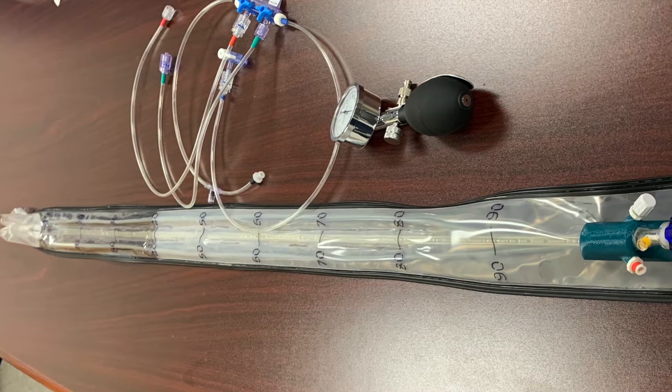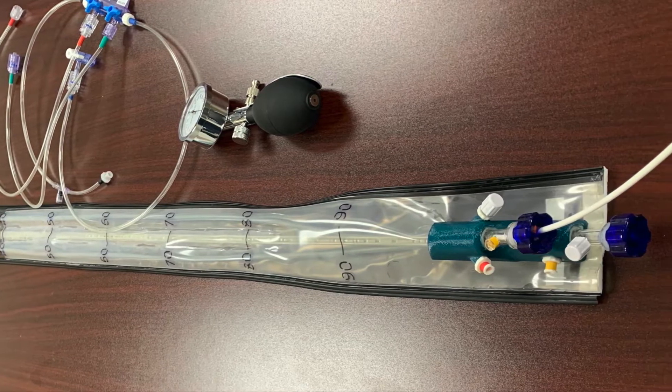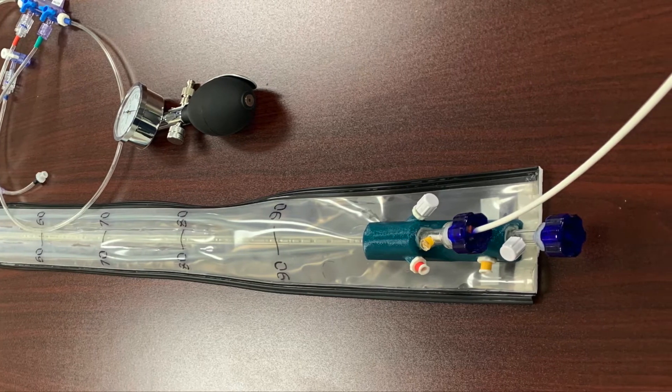Years later, and several iterations, we have Isoscope — a flexible sheet that can wrap around the colonoscope to create an on-demand overtube. It uses the colonoscope as a guide to reach the target area in the colon without the need to remove the colonoscope.